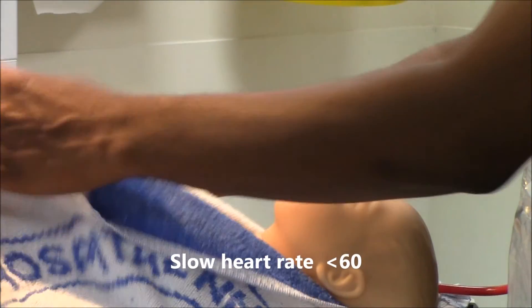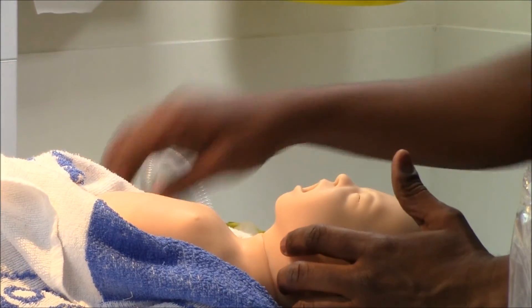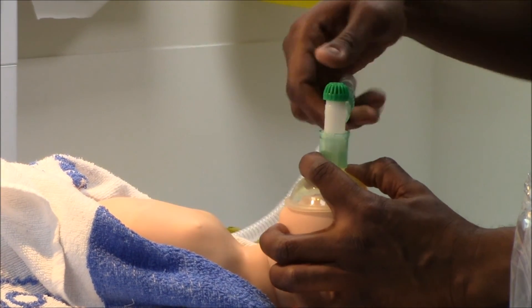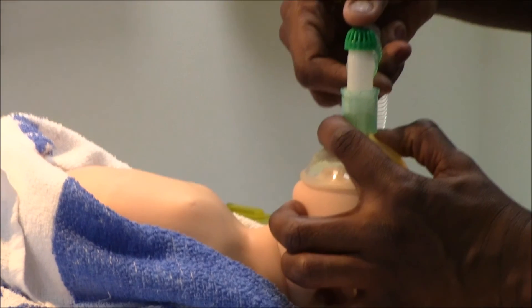I am happy with my chest inflation, so I am going to go on to chest compressions along with ventilation breaths — ventilation breaths over 1 to 2 seconds.